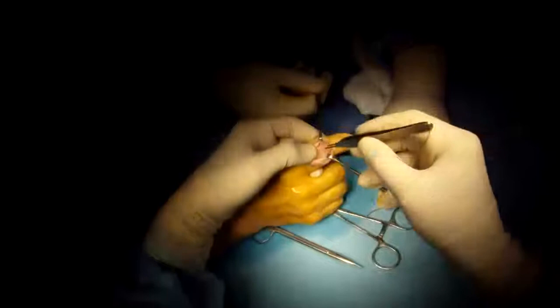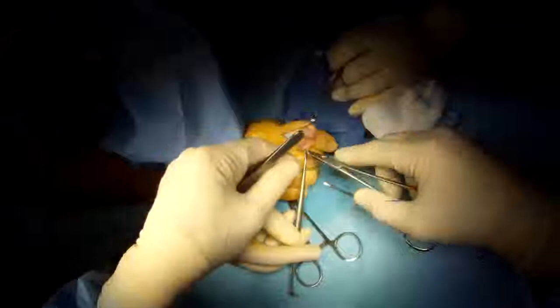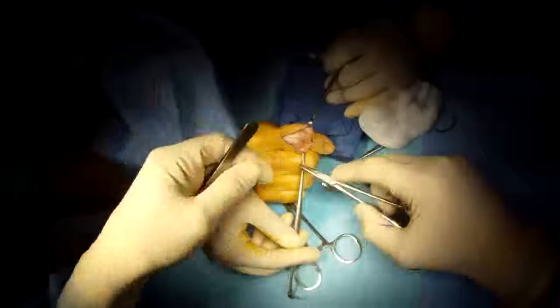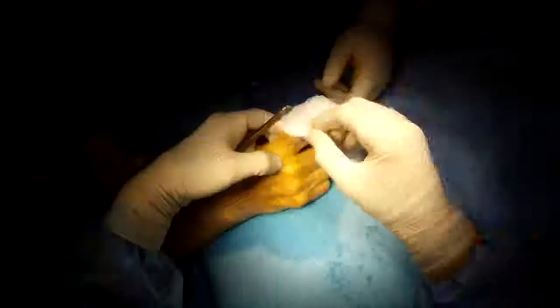Fixation is stable. The alignment is good. The bone removed — a thin slice used as bone graft to facilitate healing and speed it up. Close the extensor tendon, then close the skin. All done, and together well.